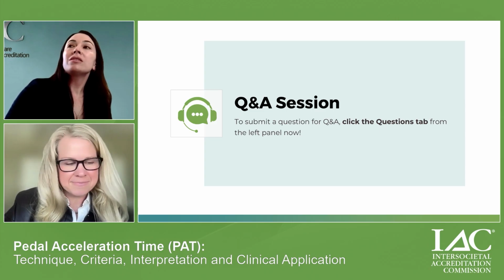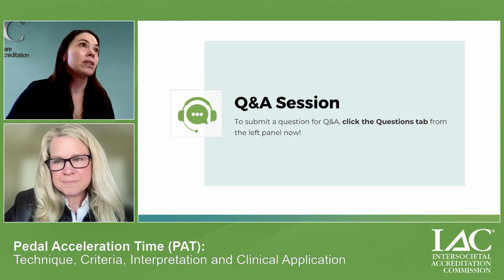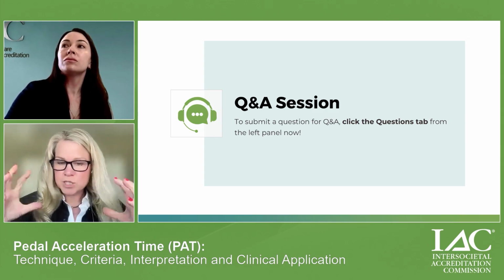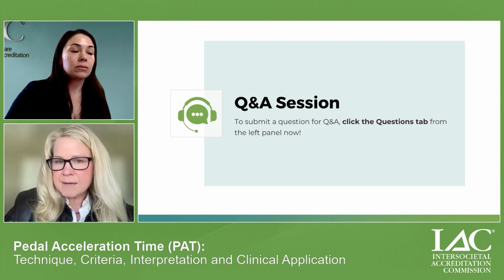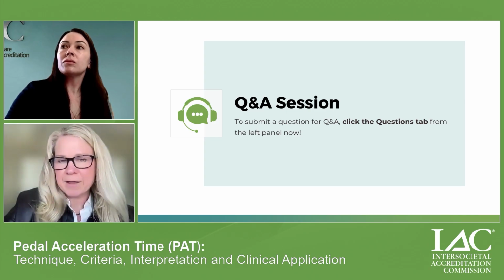There were a couple other questions regarding the time allowance. How long do you allow for pedal acceleration exams in your lab? So for the pedal duplex ultrasound, if we're just doing PAT in the distal tibials, it's about 30 minutes, just to familiarize yourself with the communicating arteries and the target artery pathway.